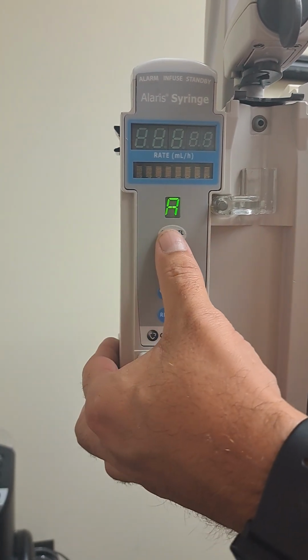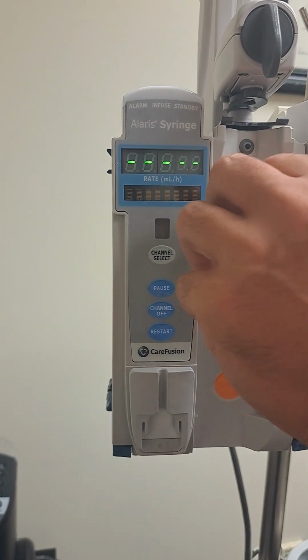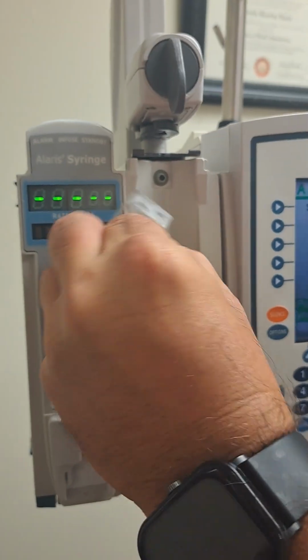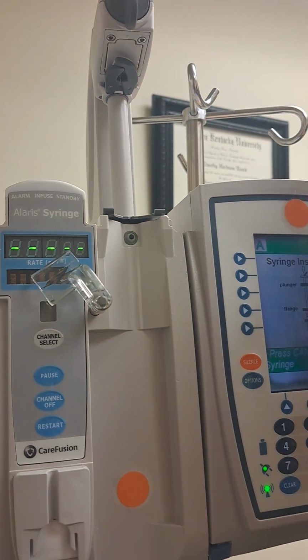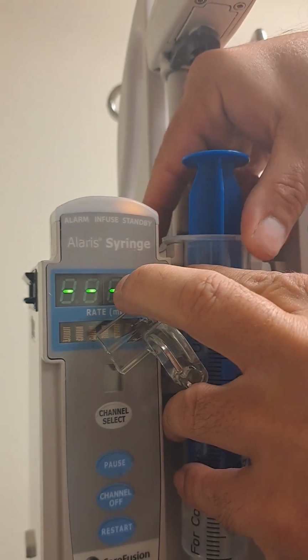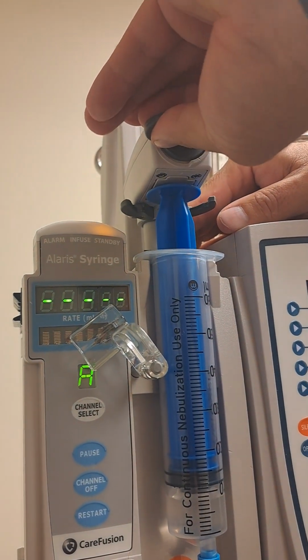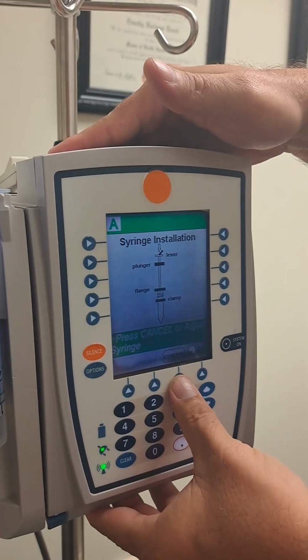Press that button. And once I press this button, then a diagram will come on over here on how to put the syringe on the pump. Okay, I'm going to pull this back and I'll twist it over. I'm going to twist this and raise it up. My syringe goes in just like this. You press it in there. You lower this down on it and flip this around to hold it in place, and on this screen you press confirm.